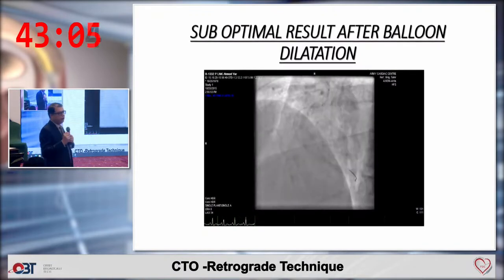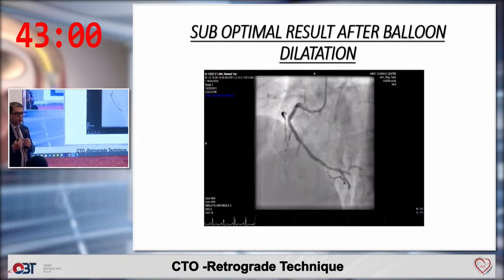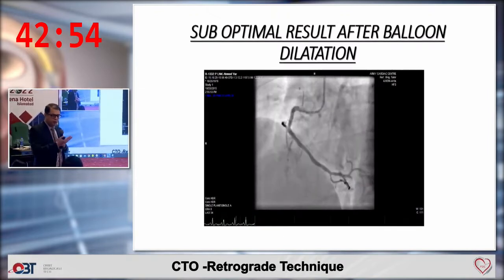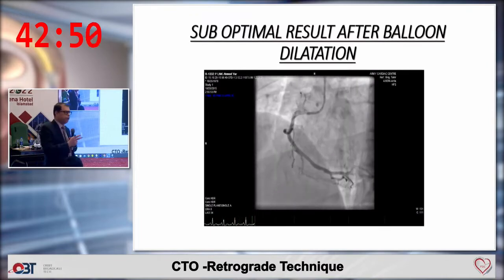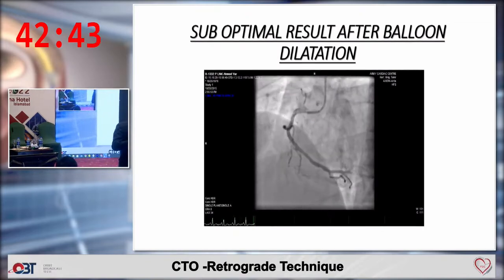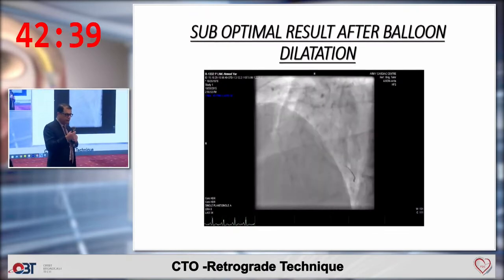And always remember that bad things happen when you pull. So once you are pulling on the RG3 or the microcatheter, the guide will get sucked in. So you have to disengage the guide. Whenever you are pulling any equipment in a CTO PCI, always remember that when you are withdrawing, bad things will happen. So always take your guide, disengage it completely, and then pull.